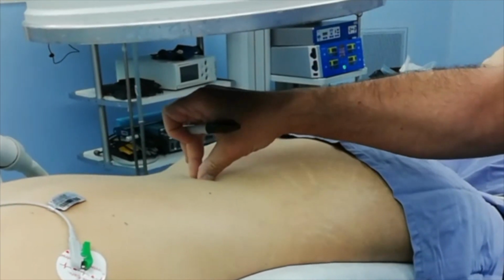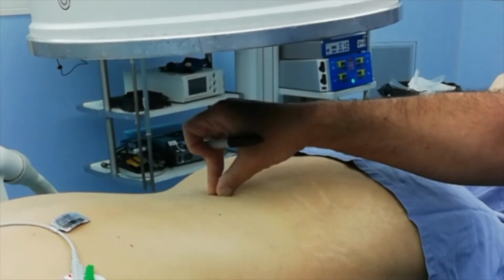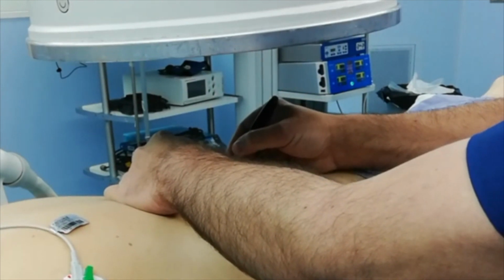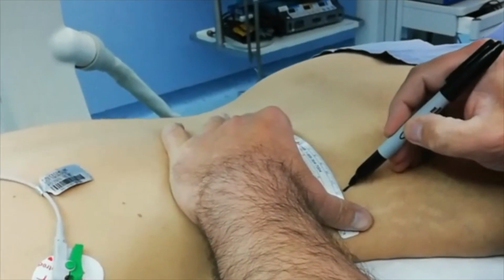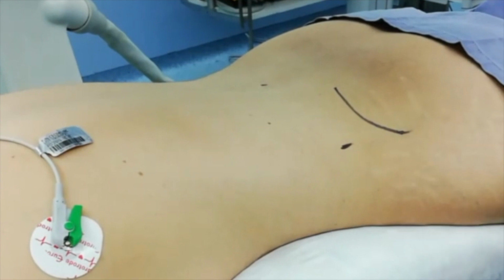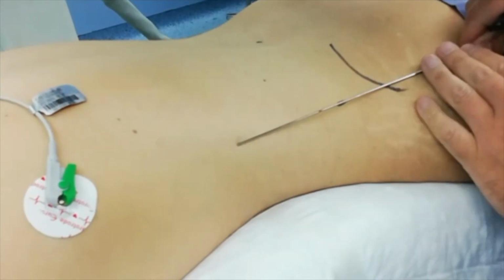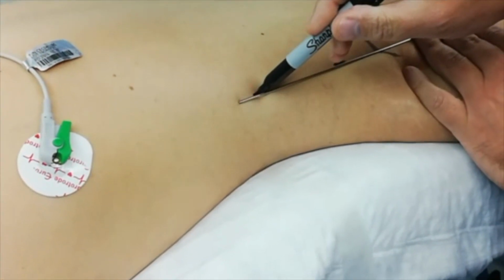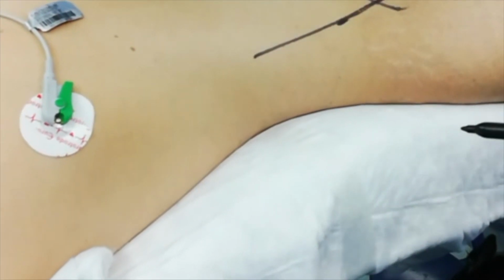So the procedure really depends on the entry point for the needle and the landing point for the needle. So entry point of the needle, what I do is mark the midline here, and we will take 12 centimeters from the midline. This is the iliac crest. So parallel to the midline, this is my parallel line at 12 centimeters. And this is the first line we need to draw.